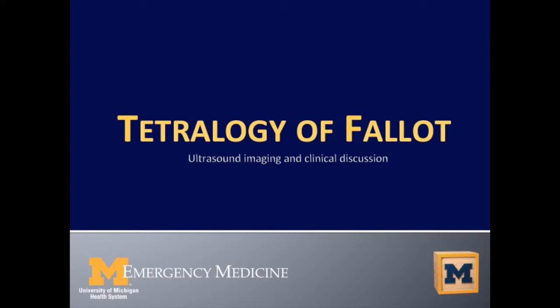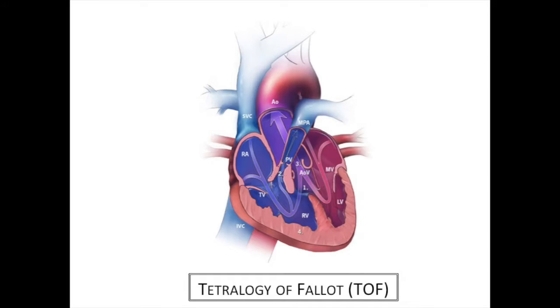I am really excited to talk to you today about 2 scans done collectively by the good doctors Whitmore, Wong, Tomlinson, Eddy, Todd, and Mays. We're going to talk about Tetralogy of Fallot today. This congenital heart condition is most often repaired in infancy or childhood here in the U.S. Today we have 2 examples of adults with unrepaired Tetralogy of Fallot seen in the adult ED.